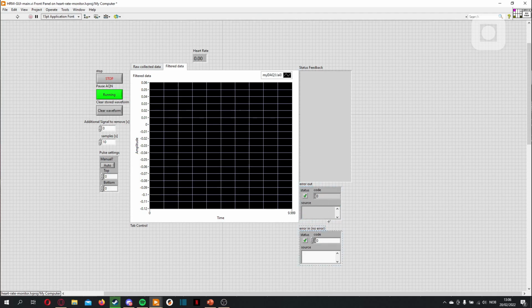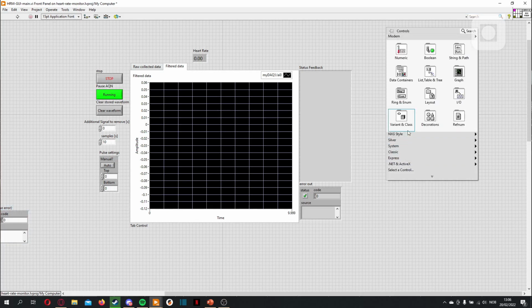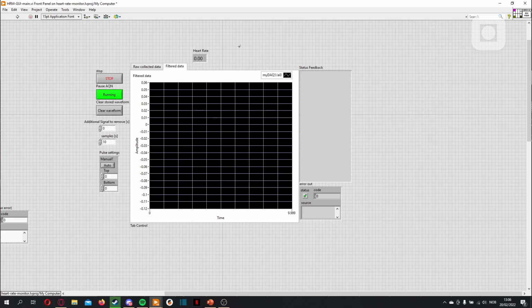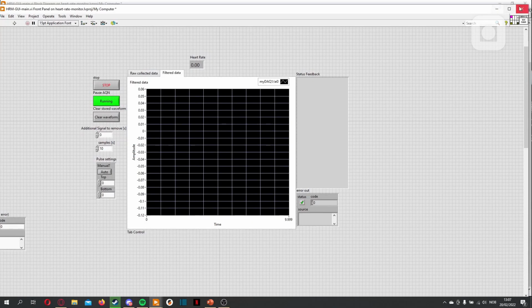Now, the error in isn't all that important, so I usually just move it out of the screen. Now you have your graphs. There are ways to make it more complicated. I won't go through it, but you can have these horizontal and vertical bars, which you can set as limits for certain things, and you can say that the button should follow the left one, and then the graph should be as big as it can within those, so the screen adapts to your screen. Because right now, it doesn't matter if we have it small or big, it's the same.